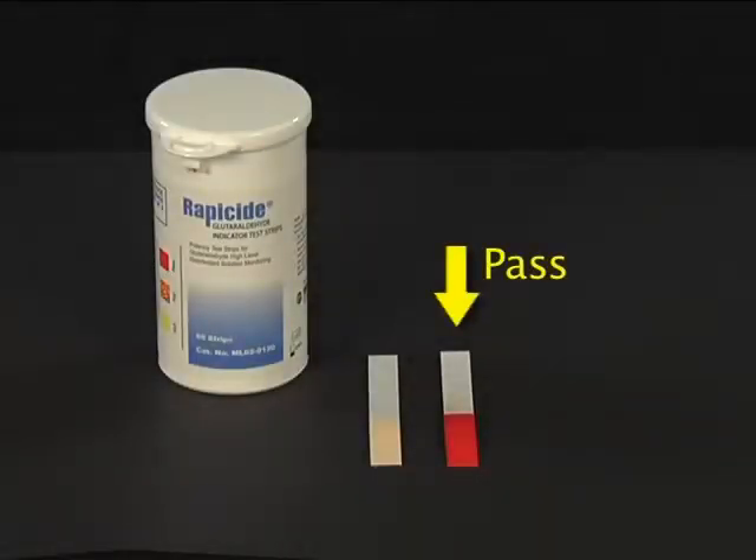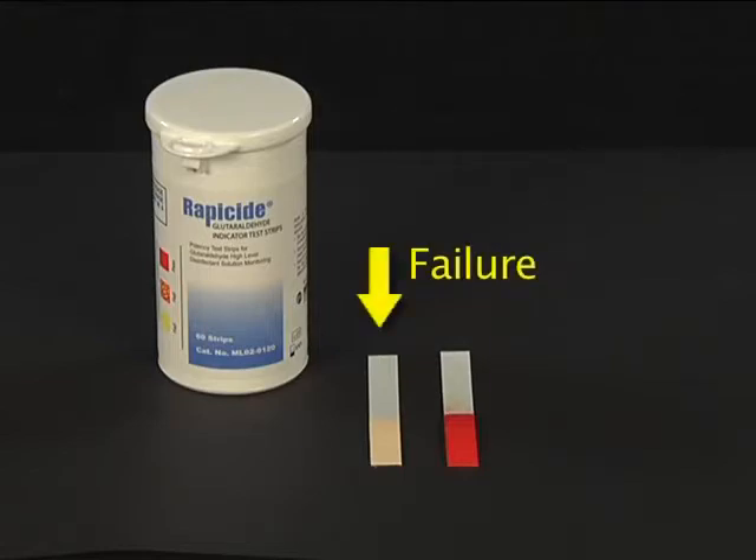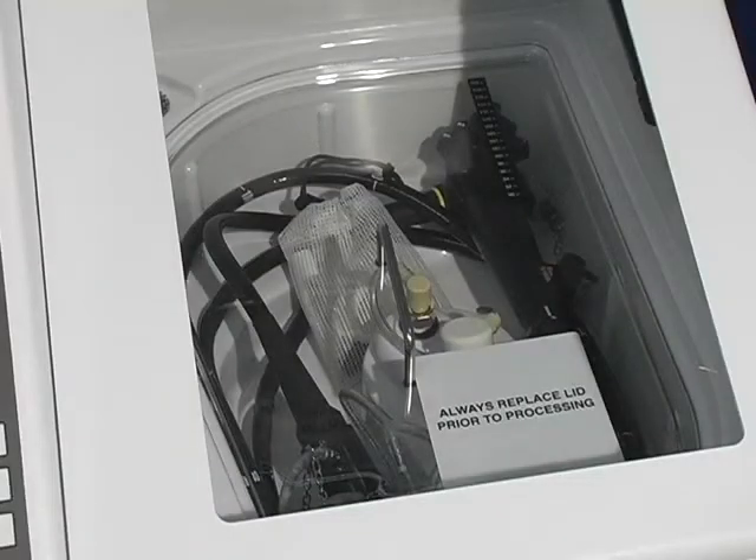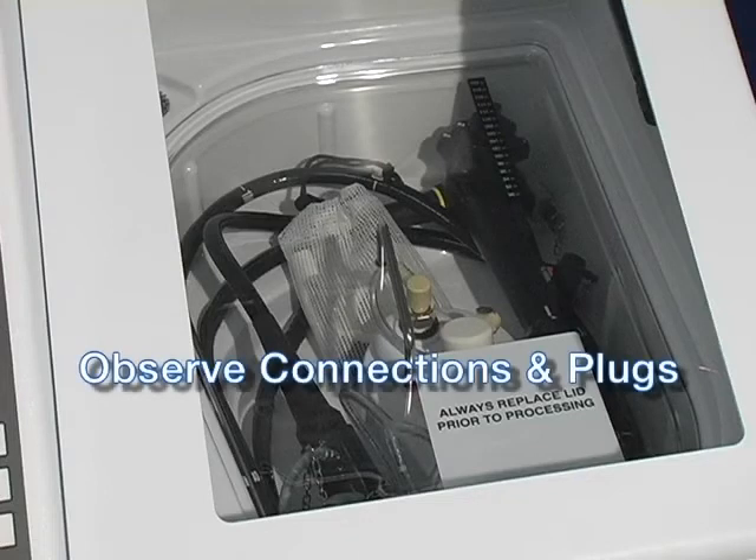If the test strip indicates a failure, the disinfectant is not potent enough to be used for high-level disinfection. Press the Cancel button, then dump and reload with new disinfectant. The first operation is the flush cycle, unless you have a DSD-201 with a leak tester. With the leak test option, the first step is the inflation and monitoring of the scope, which lasts approximately 40 seconds, then the flush cycle begins.